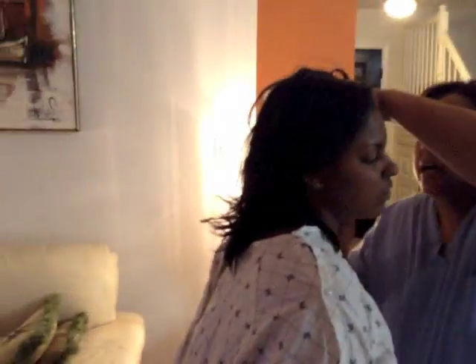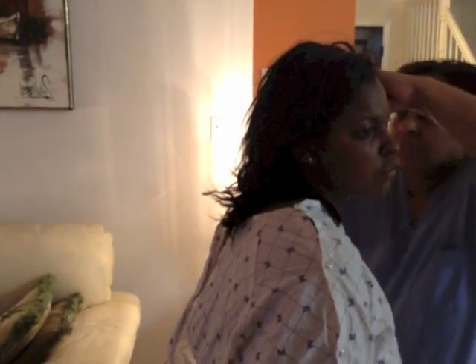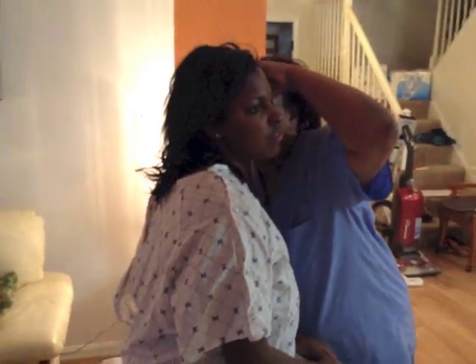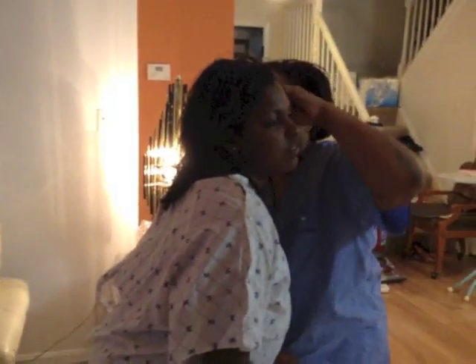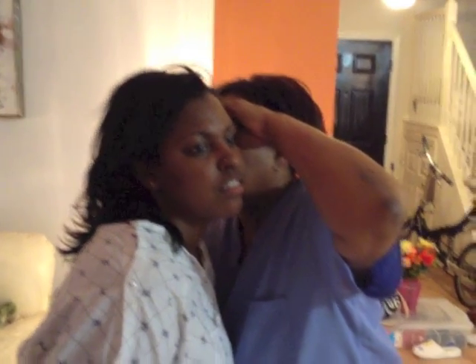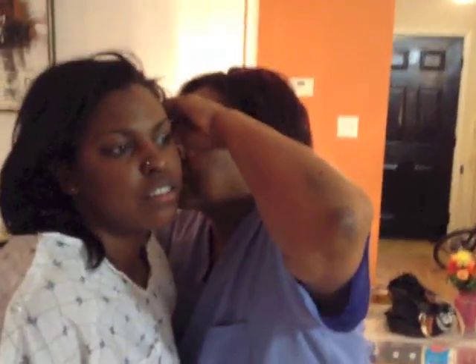I'm pulling your pinna upward and backwards. You got to come a little closer to me because I can't see. I'm looking at all directions of the tympanic membrane and looking at the external ears. I'm inspecting the eardrum right now.